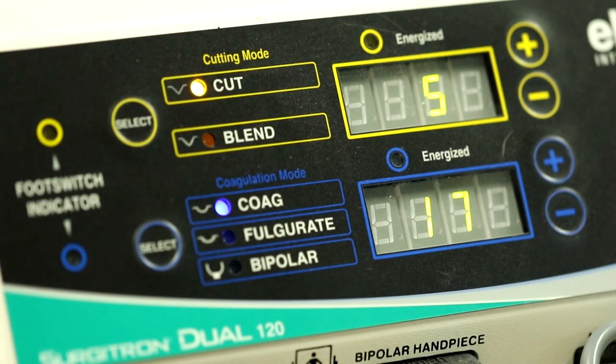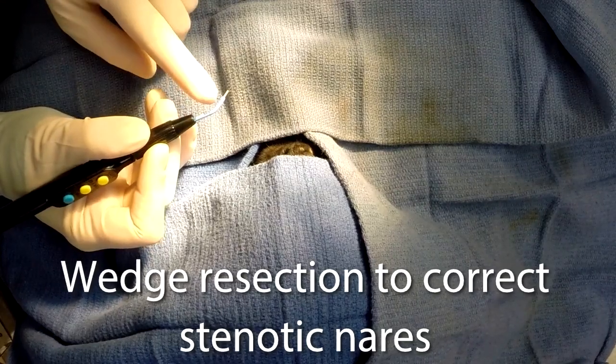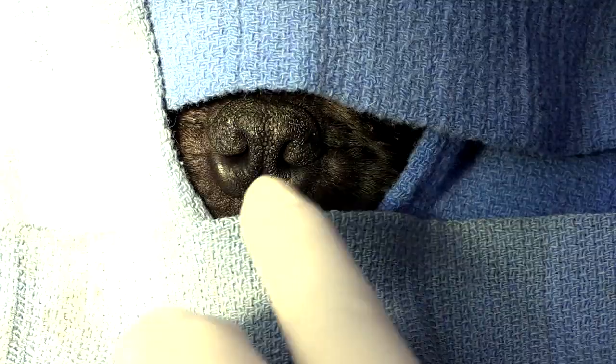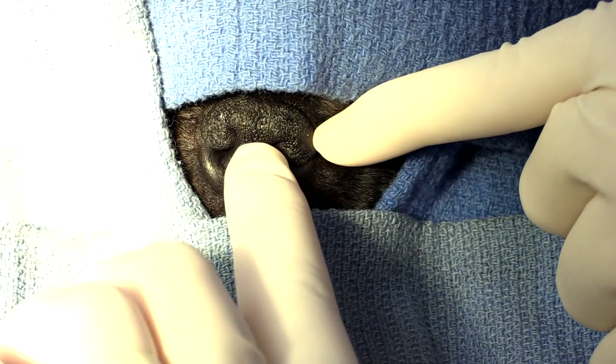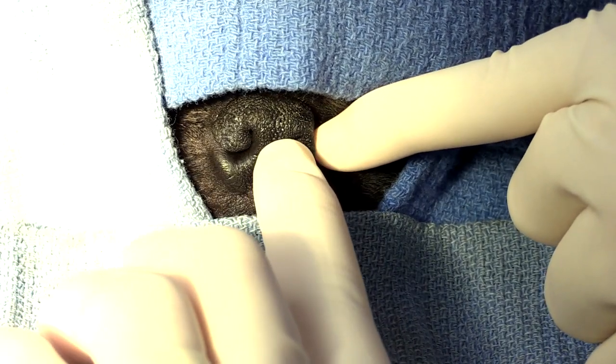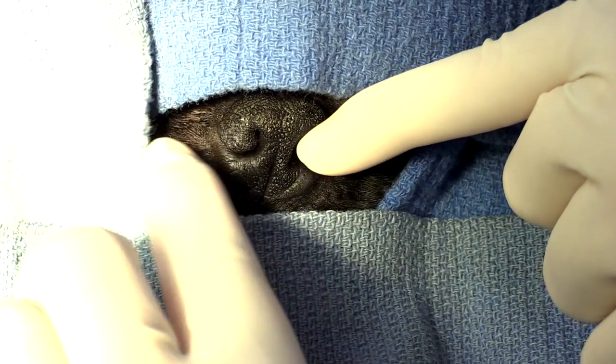So today I'm going to be using the Elman — this tip is the A8, it's just a personal preference, but this is a nice cutting edge. The angle I'm going to be coming in is on this little outer fold to make an incision right there, and then literally pull those out so that we open up the nares.